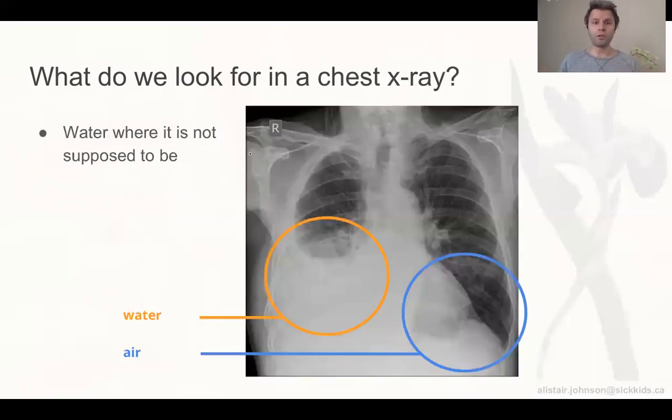Alternatively, of course, you're also looking at the lungs. You're looking for what you want to see in a good pair of lungs, right? Nice, full of air. So if you see some kind of water in there pooling at the bottom, especially, then that's clearly something that you want to understand why that's happening, and maybe figure out if you can help the individual to overcome this illness.